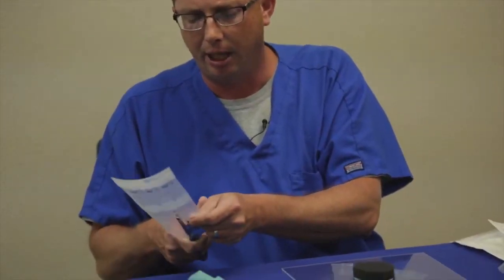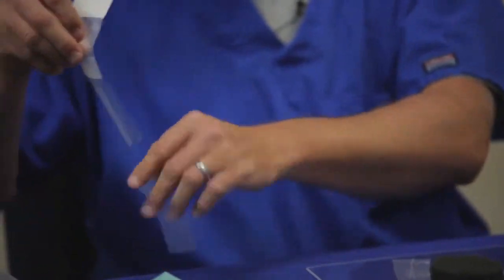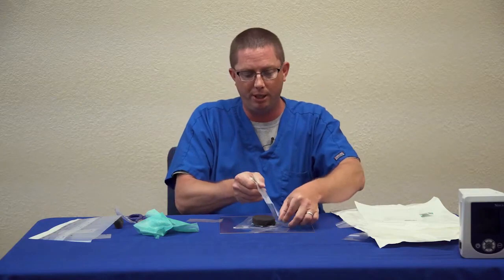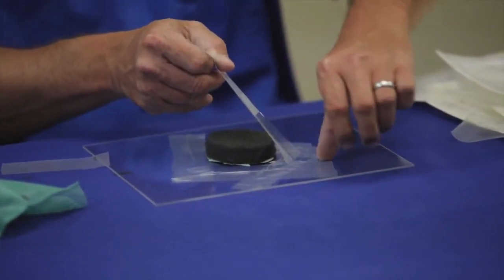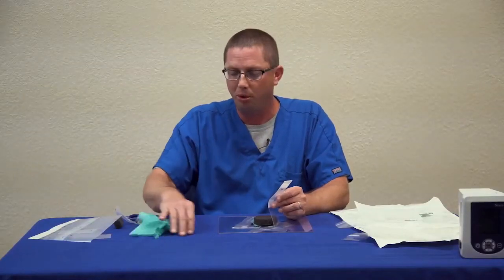And again, I start with a 1-inch piece. I go to the most difficult area that I know is going to be difficult to seal. So if there's a crack crevice here, I would cut a little 1-inch piece, take my thumb and actually push down into this crack crevice, because I know that's where I'm going to leak. Because again, negative pressure with wound therapy is nothing more than applying vacuum to the wound base.